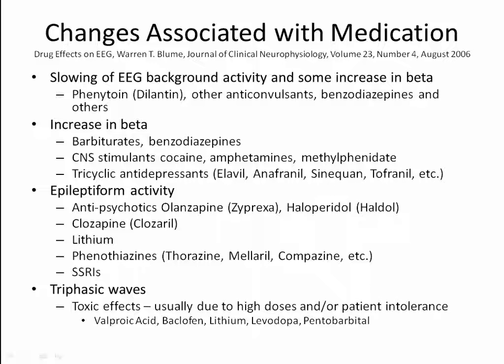And so the background activity is considered the basis of the EEG, and this finding is suggesting that the frequency of the background activity, which in the waking person might be a certain frequency in the beta range, in the eyes closed individual it might be in the alpha range. This is suggesting that these medications can cause that to slow.